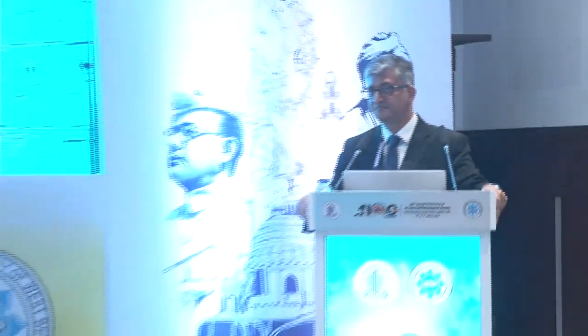Just to comment on the LALs, I would say that with LALs, you can only correct up to 3 diopters of astigmatism and 3 diopters of myopia or hyperopia. And for low levels of keratoconus, I have found you can get some good results. However, I just caution, the LALs are great, but I just use caution even with keratoconus there. I think just like with the toric lens, there is some utility. However, it's not the panacea.